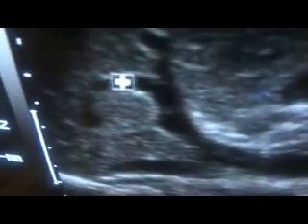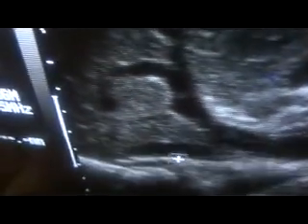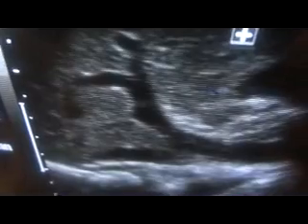And so this picture shows us the division into posterior branch, anterior branch. This is the portal vein. This is the IVC. Parenchymal echogenicity is normal and homogeneous. There is no focal lesion seen.